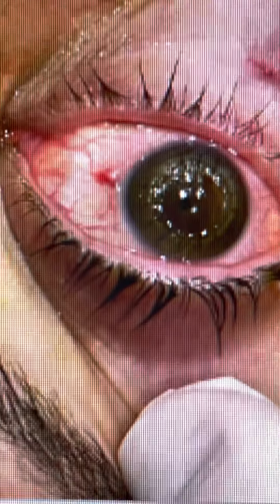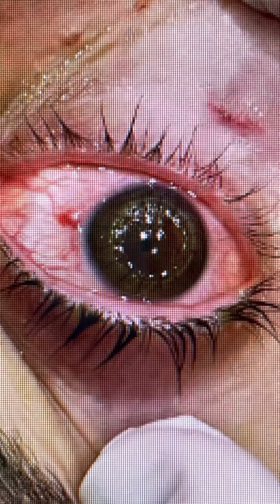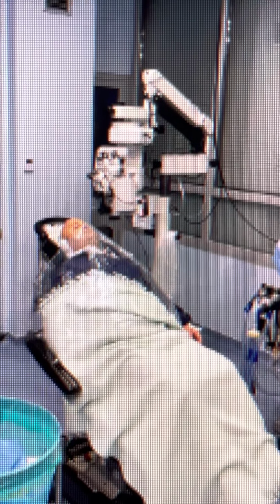Try and get a little better focus here. And we can see how we've resutured 360 degrees. This is our OR, using a surgical microscope and the KXL1 device to perform the flash cross-linking treatment. Our laser treatment, we're moving now into our laser room.